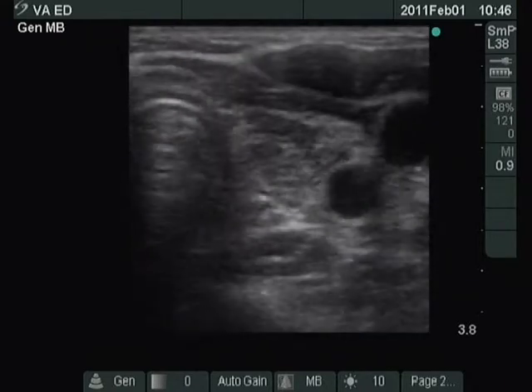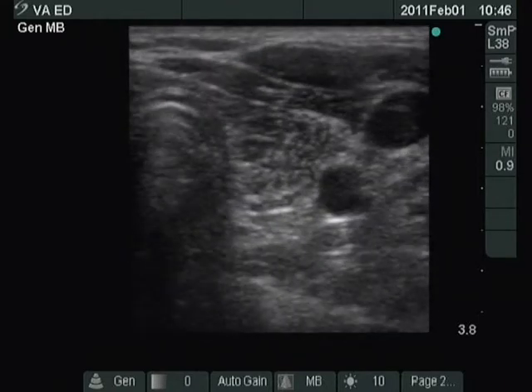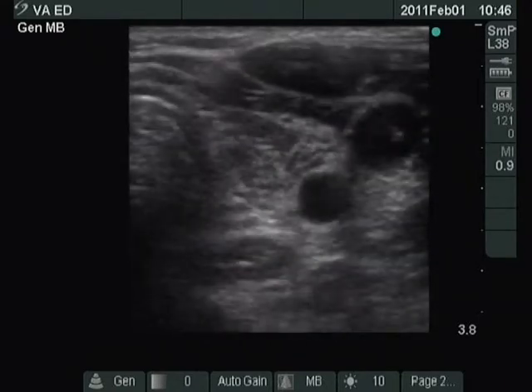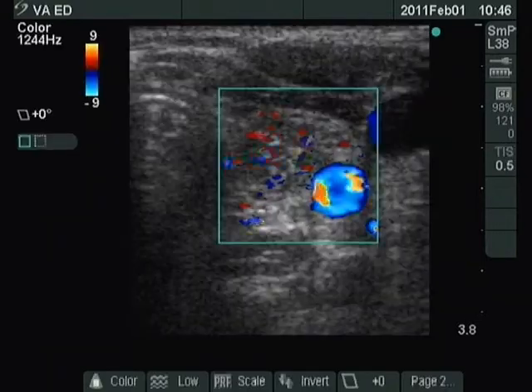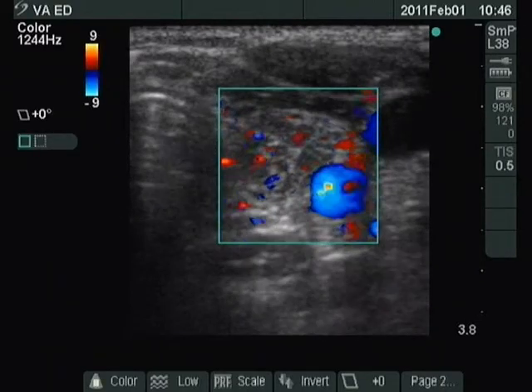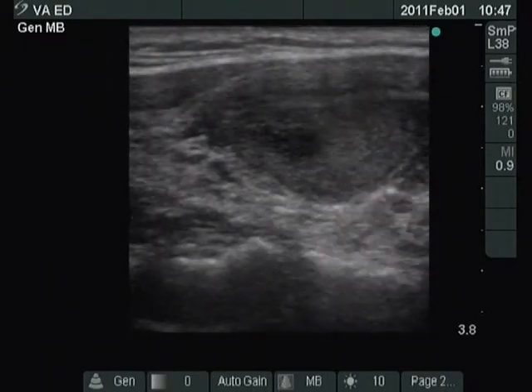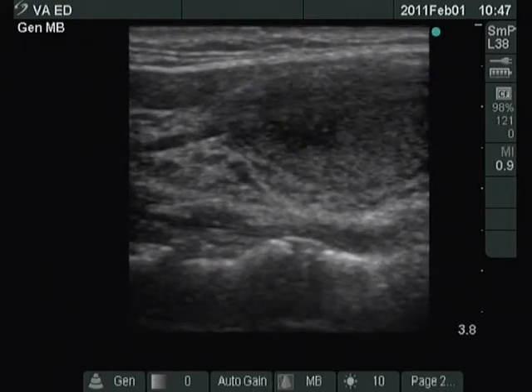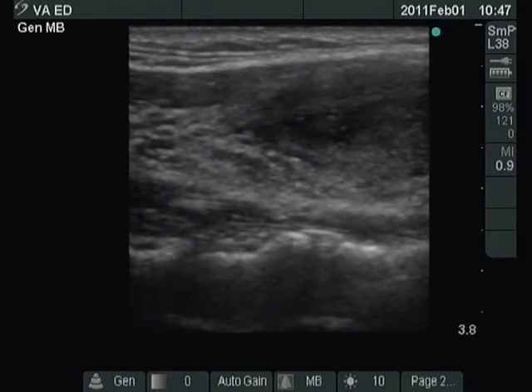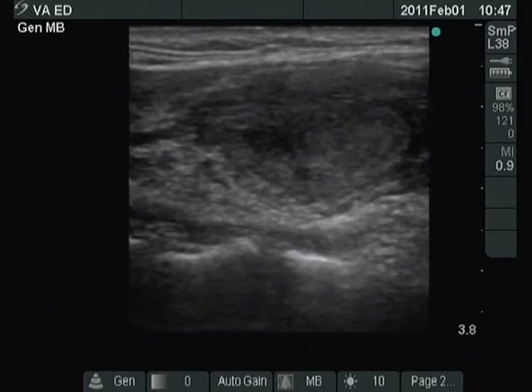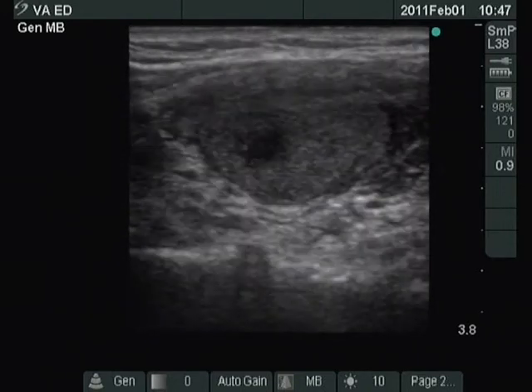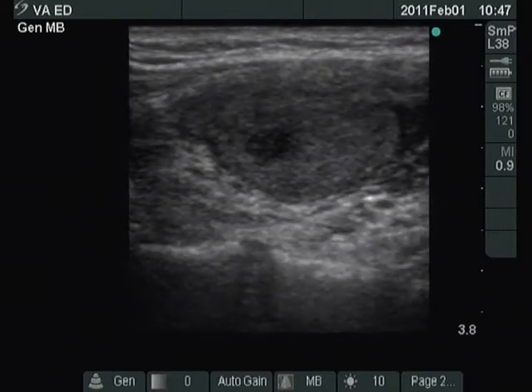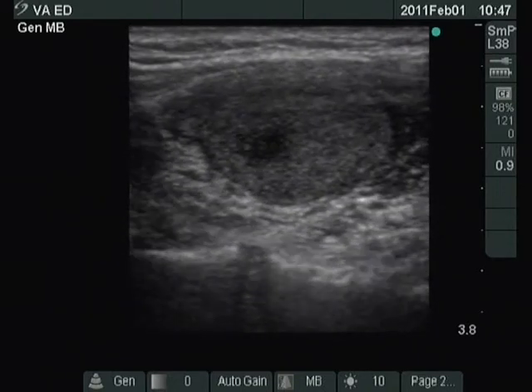The left lobe is atrophic and hypoechoic with extensive fibrotic changes. Finally, the nodule in the left lobe is demonstrated once again on longitudinal view, measuring 1 by 2 cm. Thank you.